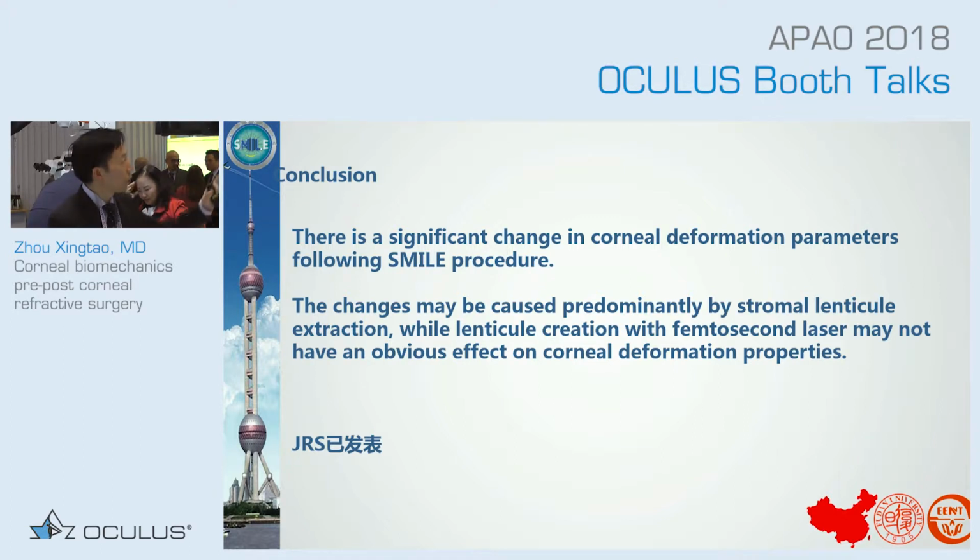This was already published in JRS, and it indicates that there is a difference between femtosecond LASIK and SMILE, as femtosecond LASIK may have flap effects because the flap is cut with the femtosecond laser.